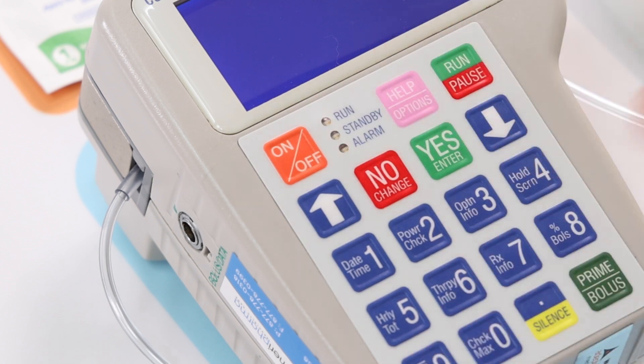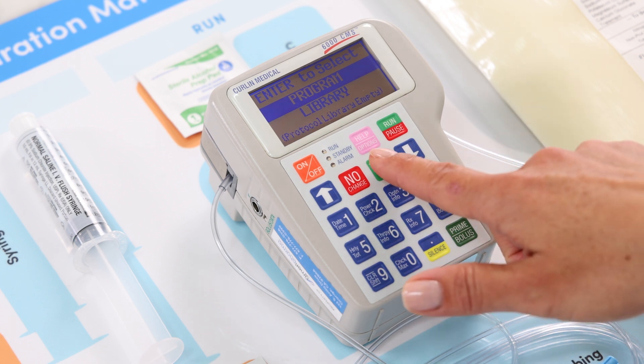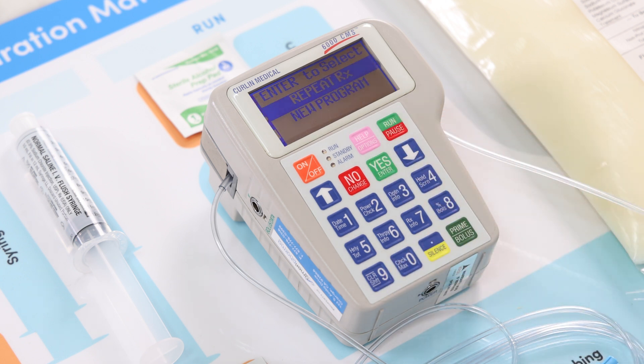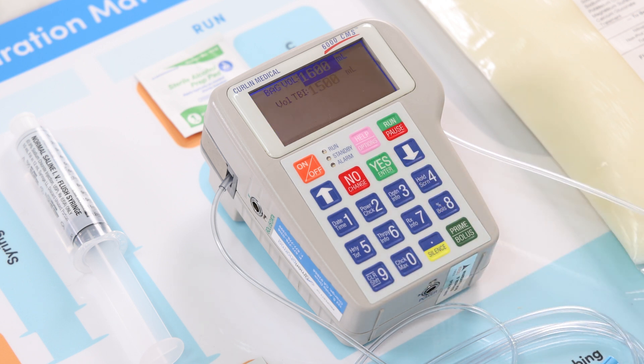Turn on the pump by pressing the on/off key. You will hear a series of three beeps and self-check screens will scroll through. The screen will now read 'Enter to select program or library.' Use the up/down arrows to navigate if program is not highlighted, then press the yes/enter key to select program. Next, there will be two options: repeat RX or new program. Press yes/enter to select repeat RX. The display will automatically review your medication program including medication type, interval, and dosing, and the screen will automatically advance through the program.